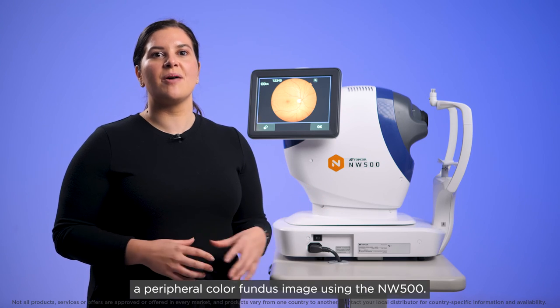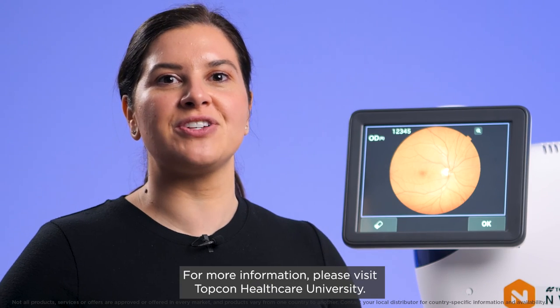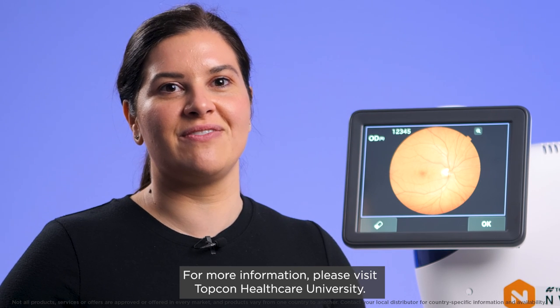And that's how you capture a peripheral colour fundus image using the NW500. For more information, please visit Topcon Healthcare University.